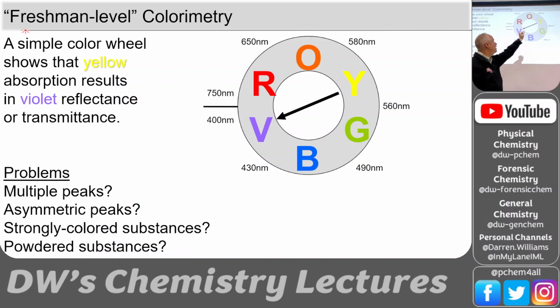If it absorbs the yellow in the 570 range, then you're going to get light that you might interpret as a wavelength of 420, but it's not necessarily the light only at 420. You're getting a little bit of red in there too if it absorbs in the yellow. Okay? If it absorbs in the green, you go straight across, it's probably a red substance. If it absorbs in the blue, it's a red or orange substance. And so you just go across the color wheel.